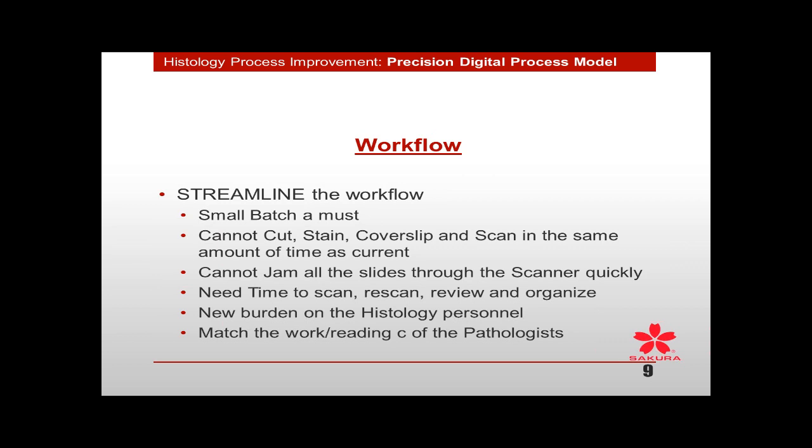If not, that's pretty much what we're talking about. You're reviewing all of that work at a microscopic level, or on a screen, which is a microscopic level, before it goes out to pathologists. So it's no more just producing, throwing it in a scanner and throwing it out. That's not going to happen anymore.